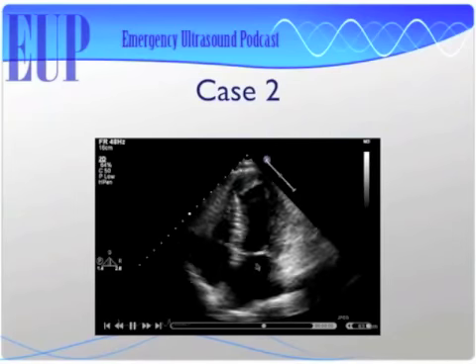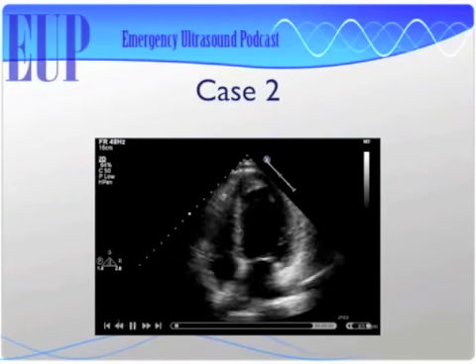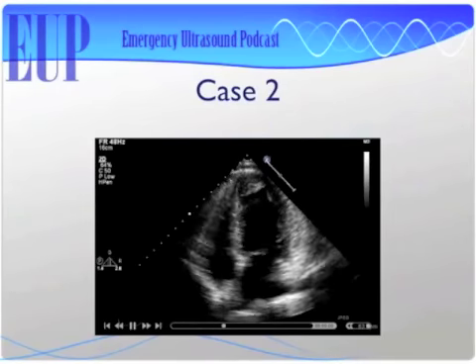So we're gonna go in order here, starting with the basal septum. How does that look? Pretty good. Okay, so we think that's squeezing all right. How about the distal septum? What do we think about this portion here?